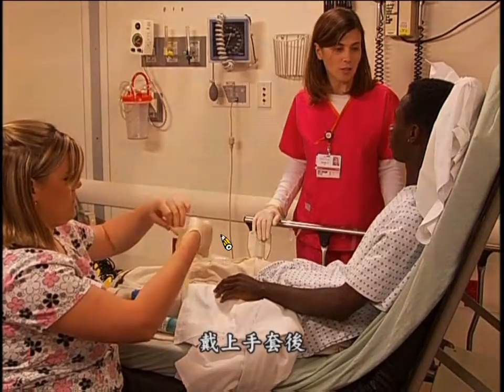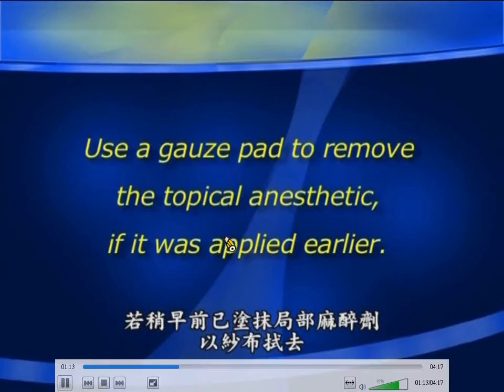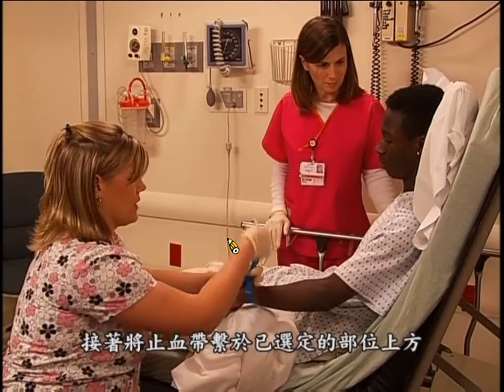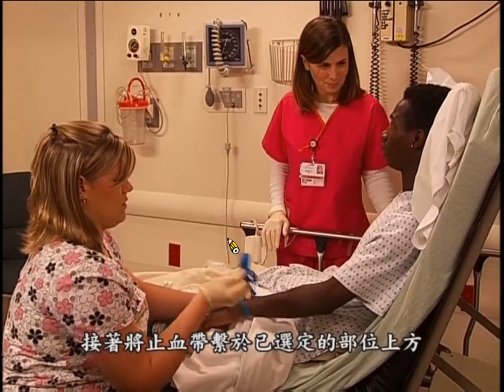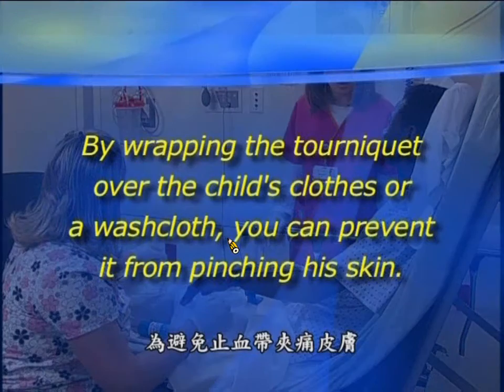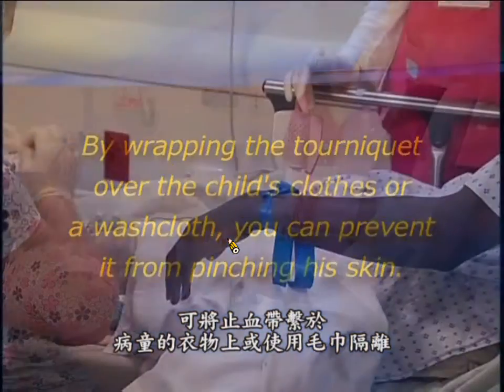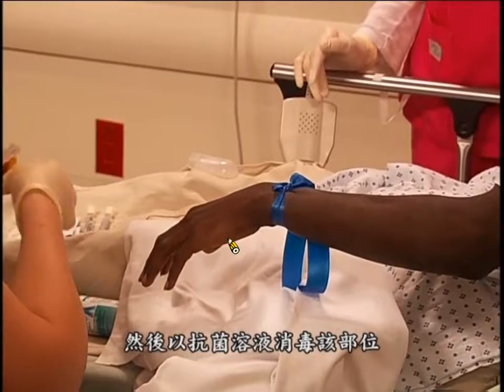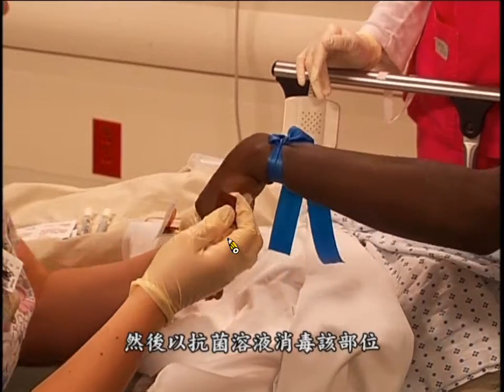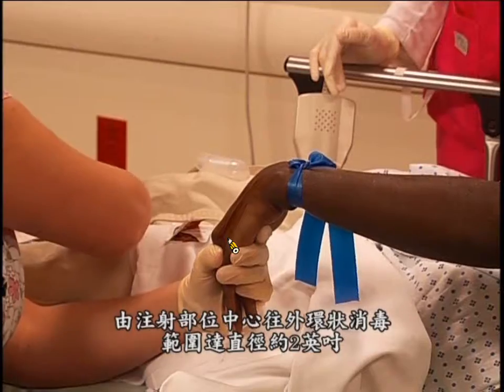After putting on gloves, use a gauze pad to remove the topical anesthetic if it was applied earlier. Then apply a tourniquet above the selected site. By wrapping the tourniquet over the child's clothes or a washcloth, you can prevent it from pinching his skin. Next, clean the site with an antiseptic solution, spiraling out from the center to cover an area about 2 inches in diameter.